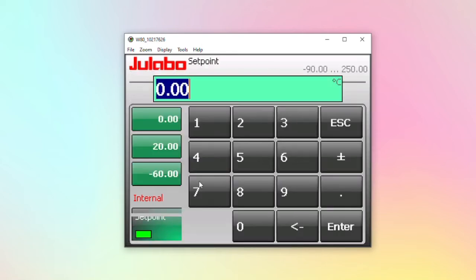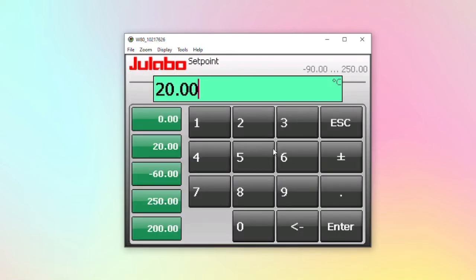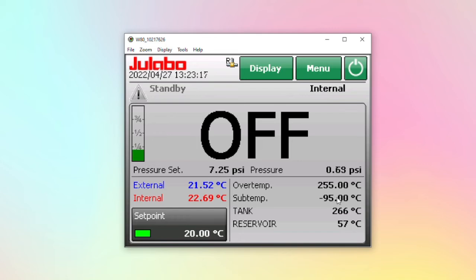If we go home, we can change the setpoint, the same as you would do on the touch screen of the Presto.